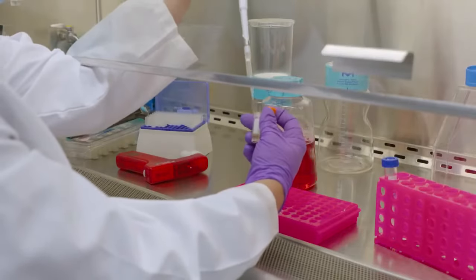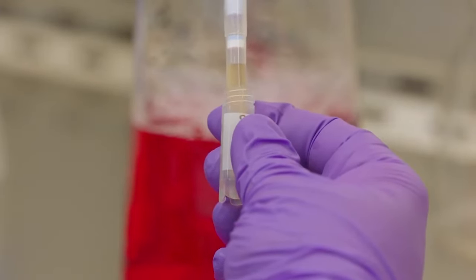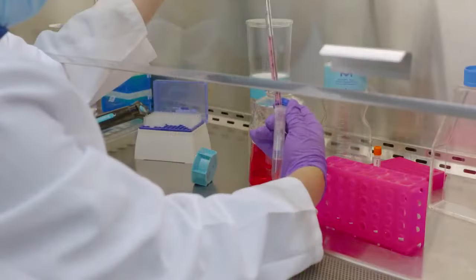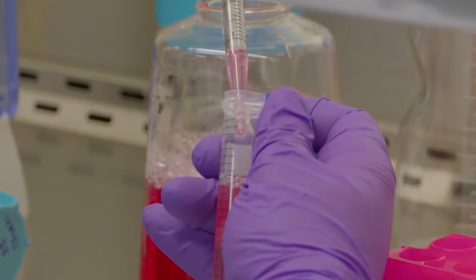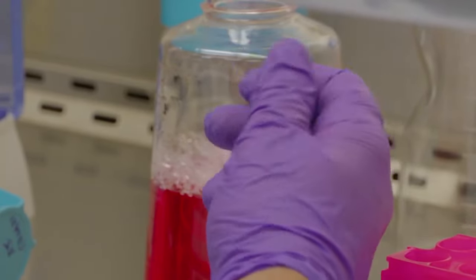Transfer cells to a 15 milliliter conical tube. Then slowly add 10 milliliters of culture media dropwise to the tube. Media is added slowly to prevent osmotic shock. Freezing media is highly hypertonic.